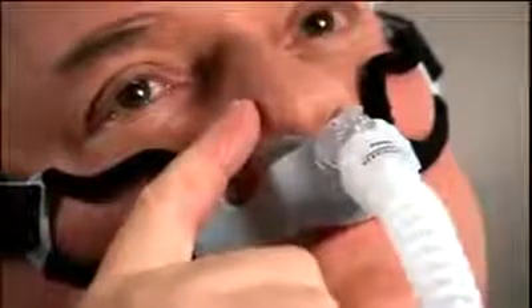If leaks are still present, press the pillow's cushion to your nostrils until the leak stops. If this eliminates the leak, tighten the headgear strap closest to the leak.